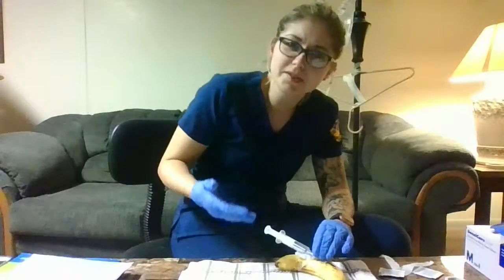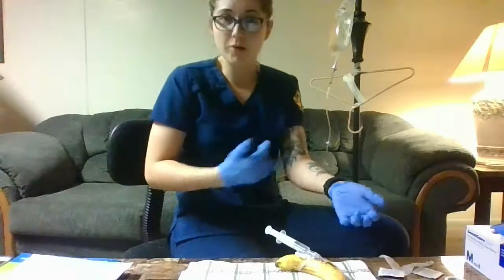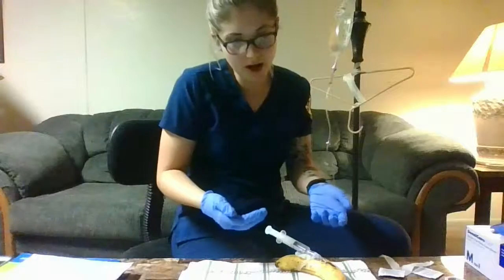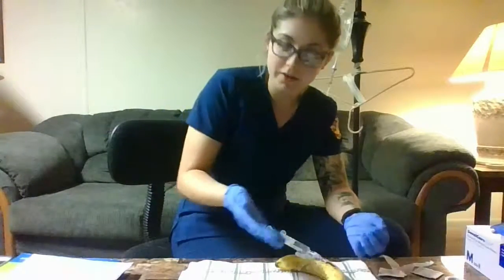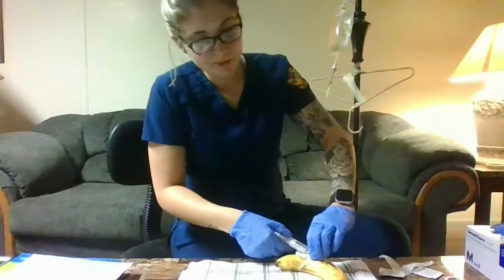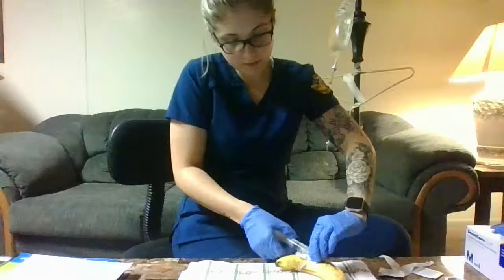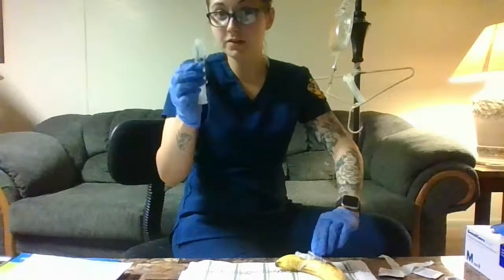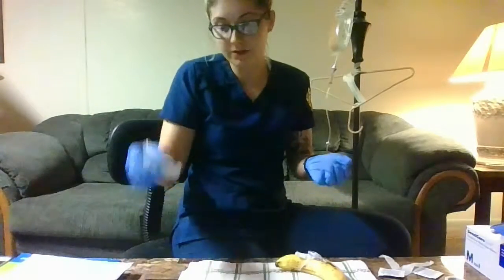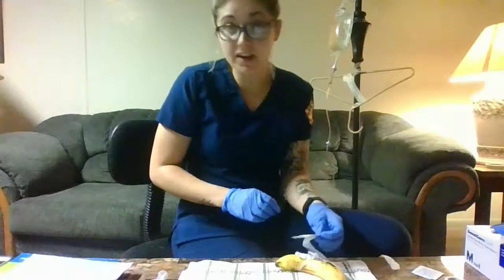And obviously if there's some resistance or you see fluid above where the site is, you'd stop. You'd have to recheck the patency of your IV. Okay. So then you're going to remove your saline after you successfully had 5 milliliters. And then you can clean the site again.